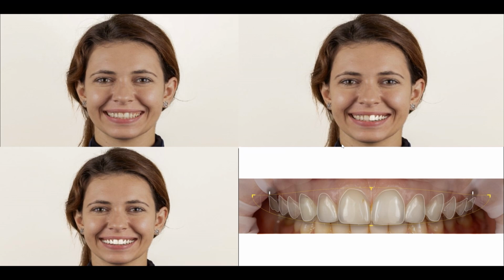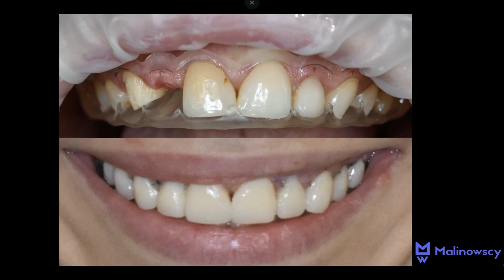Here we present the DSD that includes the coronal elongation of the lateral teeth, while the central incisors have been preserved. Here we observe a surgical template. Now I use a different type of template with a reversed layout due to the absence of need for crossing cuts.